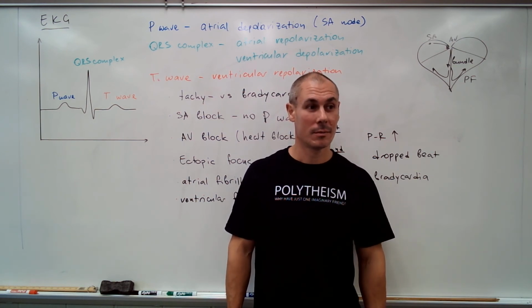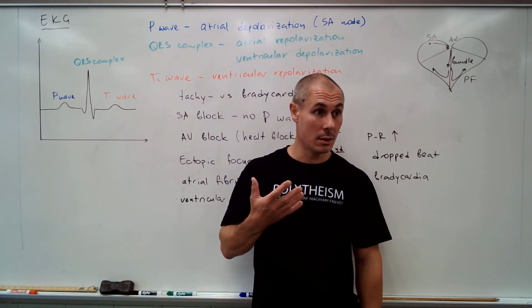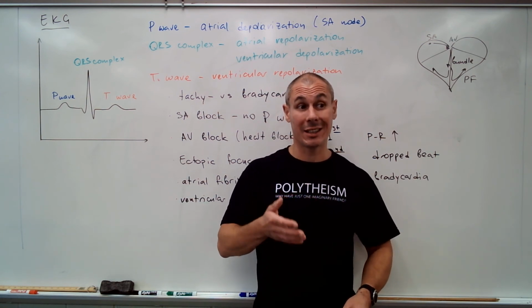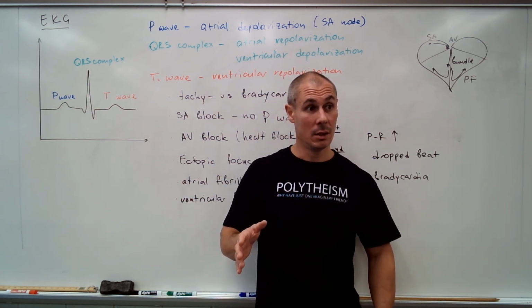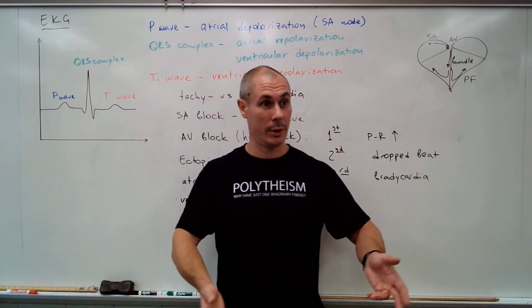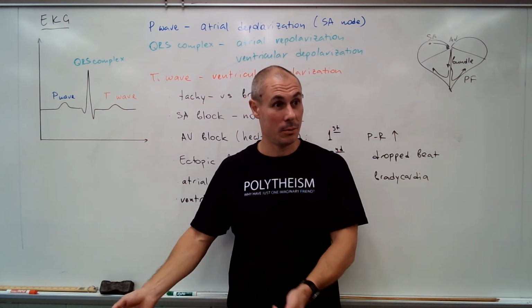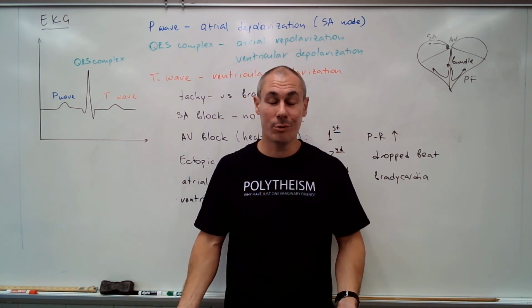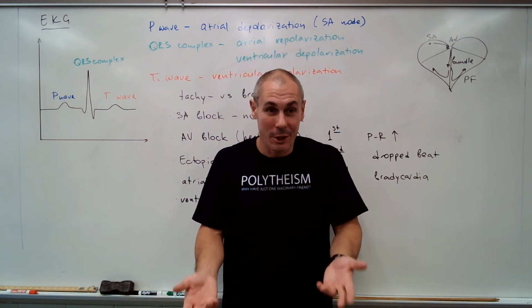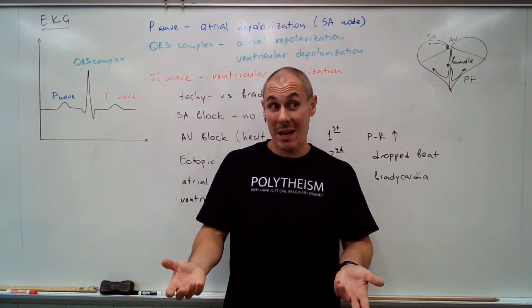What's the purpose of doing higher voltage each time? That I don't know. I don't really know. One of my hypotheses is that maybe lower voltage does not completely erase all electrical activity. So basically, we don't think of it this way. You have a person on the floor, I don't know, in the shopping mall, and you do defibrillation. You don't really know what's going on inside, do you? You don't really know what happens to the heart. You're just hoping that the higher voltage maybe helps.